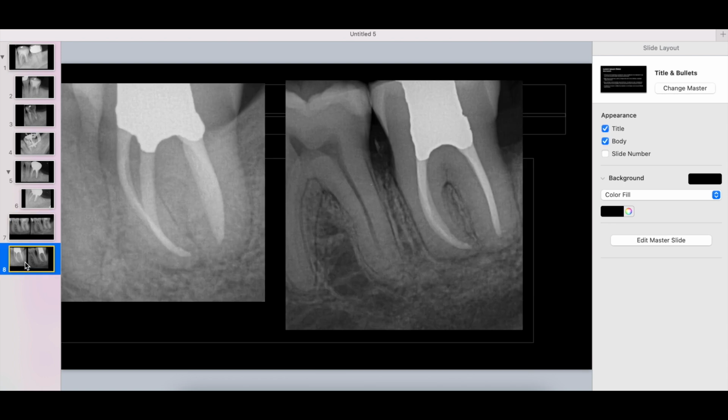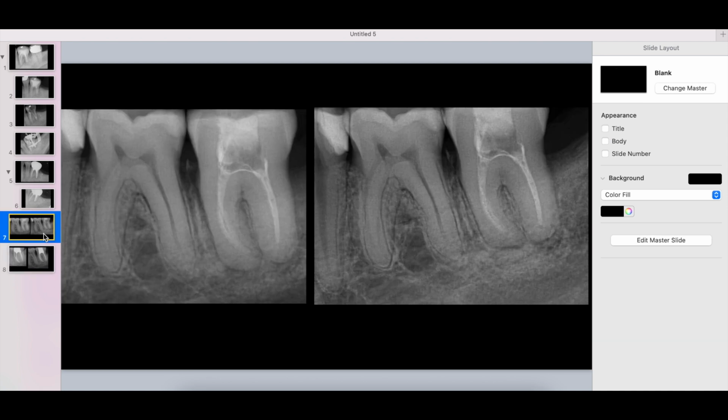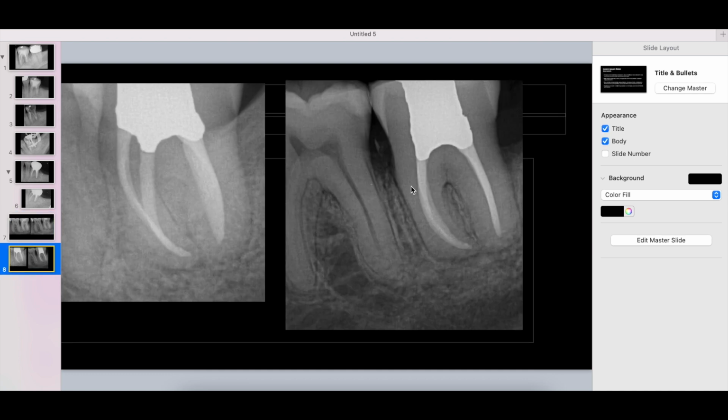So what is the outcome at the end of the day? Here's our straight-on periapical radiograph. Again, I'm really happy with the fill, and I'm happy with the PDL. It's not ankylosed, but who knows if that's going to happen. I forgot to mention we had some osseous breakdown initially, which I noticed a week after I pulled out a little spicule of bone. So we were a little concerned with the osseous crest breakdown. But here, it looks like it's starting to come back, and we're really happy with that.